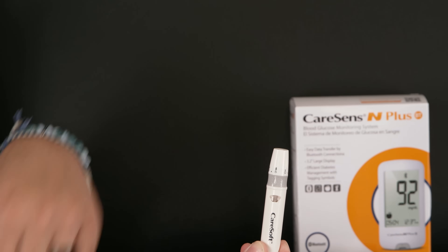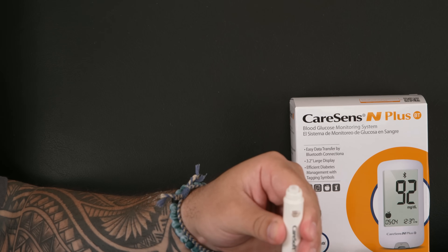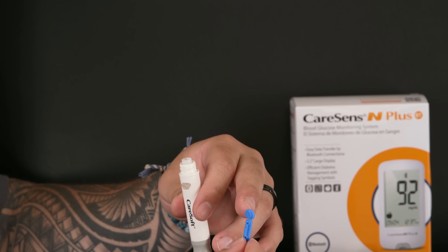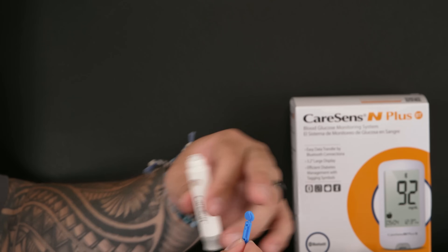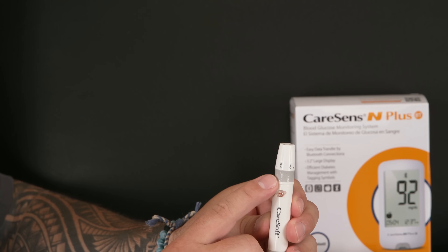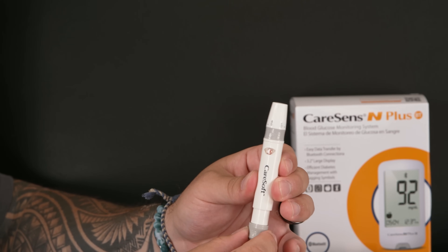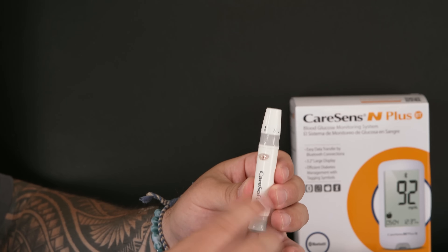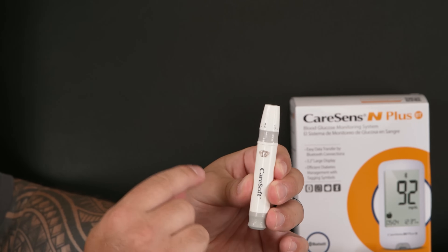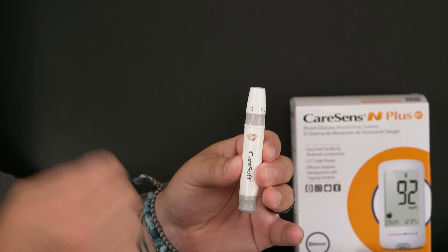Next, I want to load my lancet into the device. Screw off this portion here — here's your lancet. Keep that little top piece on for right now. Load it in, and we'll take the top piece off in just a second. Once you screw this piece off, keep it nearby because we'll use it later. Now that the lancet is loaded and set to the appropriate depth, I need to prime it by pulling down on this button — that loads it and it's ready to go.